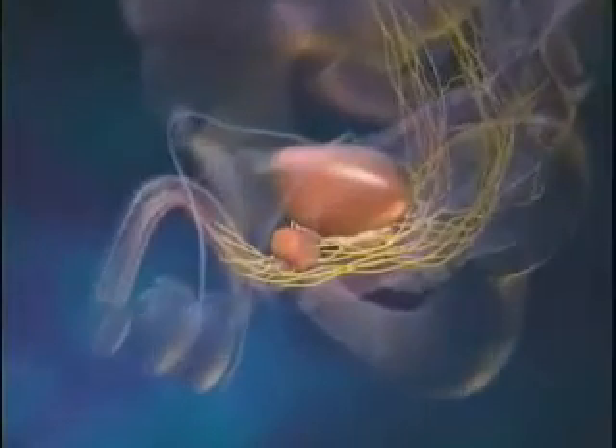The camera of the system provides the surgeon with a remarkably clear, three-dimensional view inside the body.